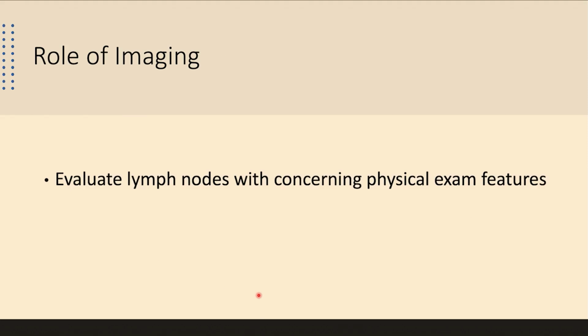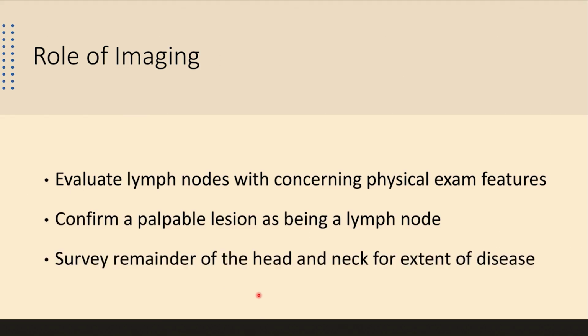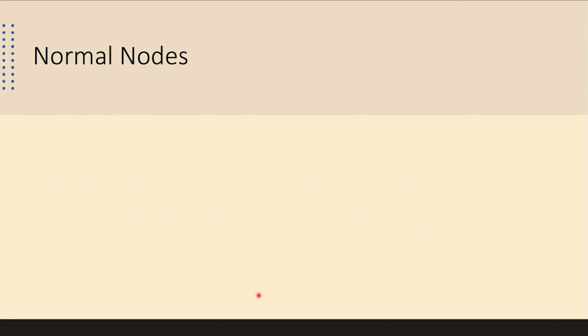Evaluating lymph nodes with concerning features on physical exam, that's the role of our imaging: confirm a palpable lesion as being a lymph node, and survey the remainder of the head and neck for the extent of disease. That's our role, right?